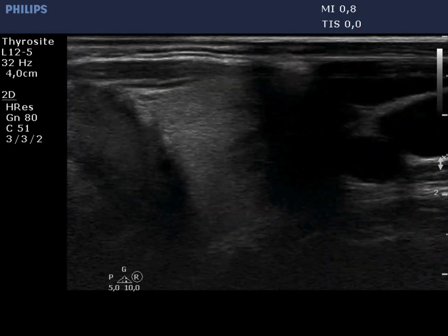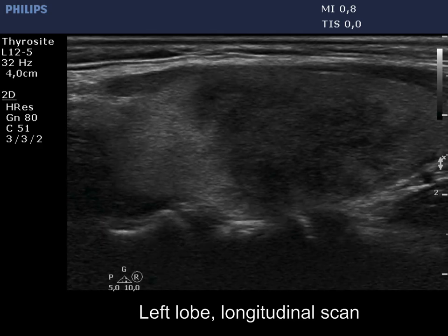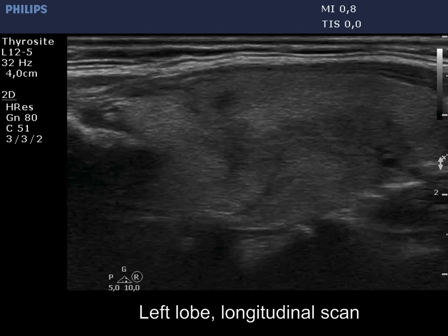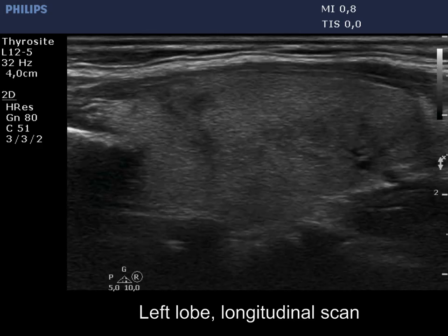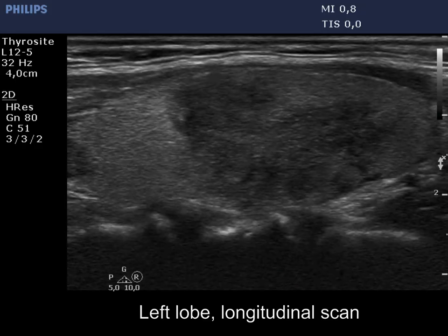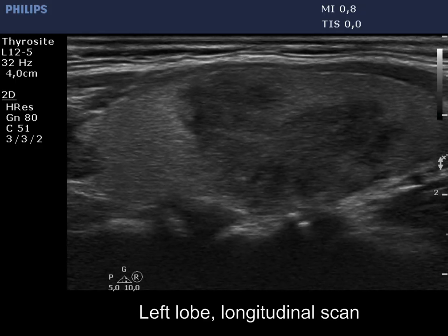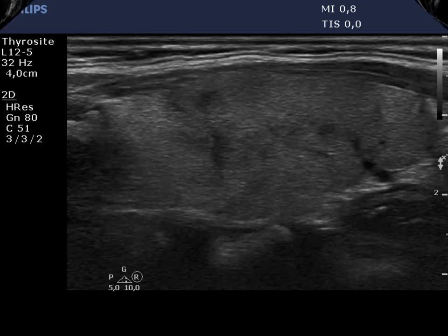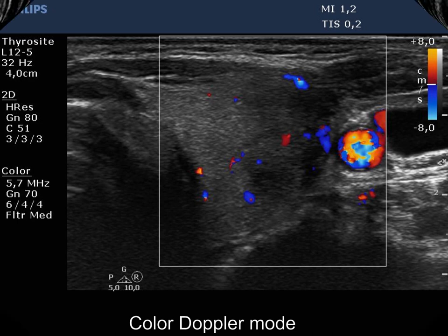On the other hand, the left thyroid became painful and accordingly the proportion of the hypoechoic lesions increased, while the vascularization was decreased in this lobe.